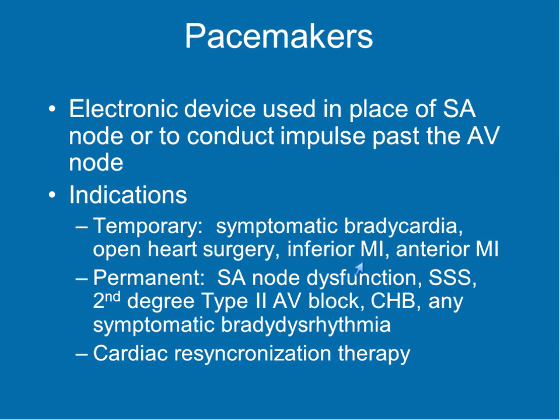Okay, a final reason for pacemakers is cardiac resynchronization therapy. That's something completely different than getting an impulse to conduct through the heart conduction system. We'll say more about that when we talk about heart failure, but since I'm recording and don't have the same constraints and pressures for time, I'll go ahead and introduce it a little bit now.